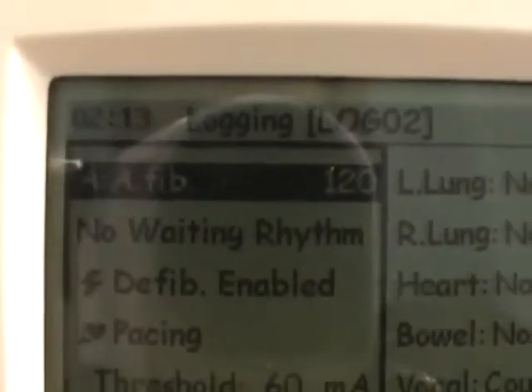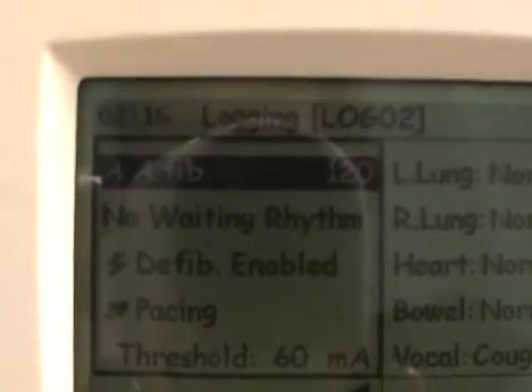So that is how you change the heart rate and rhythm on the VitalSims mannequin.